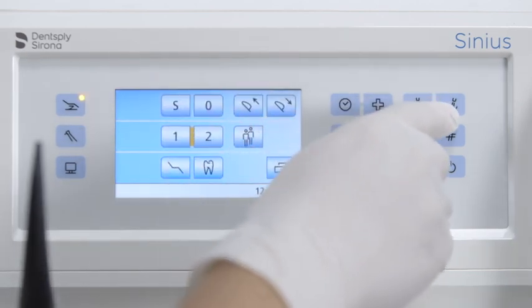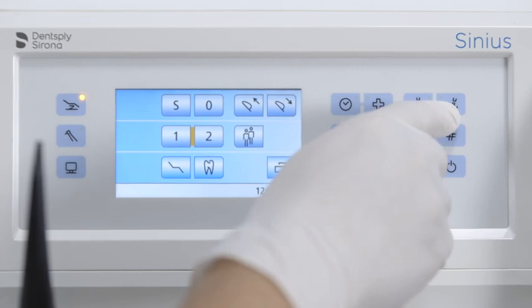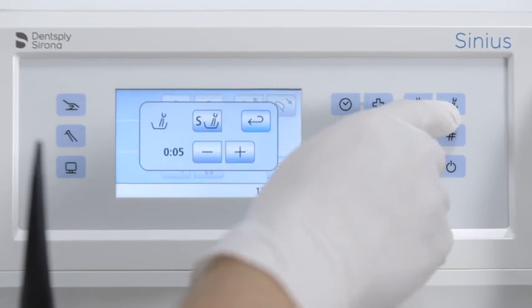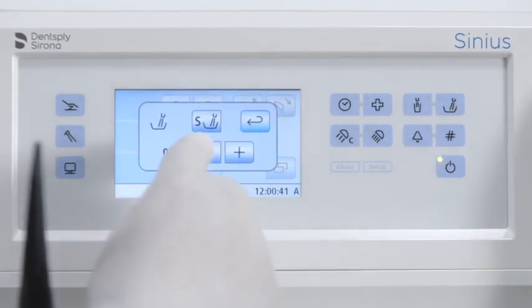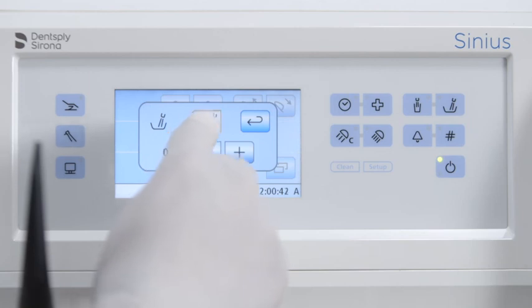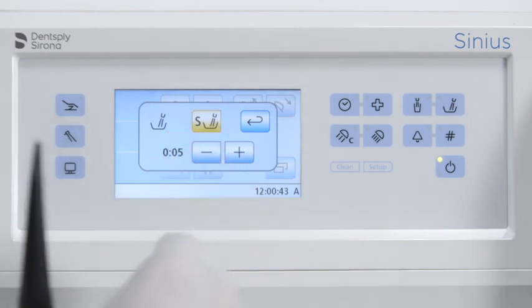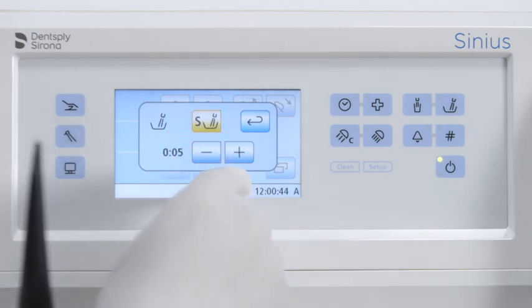Press and hold the cuspidor flushing button to go to the sub-screen. You can link the rinsing quantity of the cuspidor to the rinsing position button and set the flushing time here.